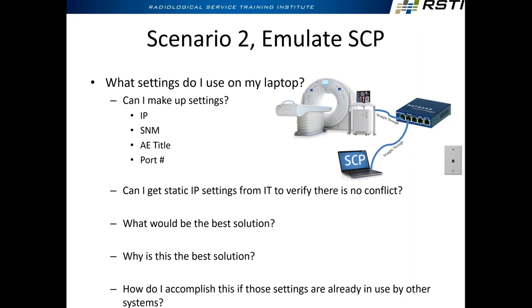Now, how do you send an image? Even if you don't know how to use the CT, you have the tech do it. Hey, send an image to PACS for me. So they're going to PACS, but in reality, it's going to go to your laptop. So you must have a switch to do this, or a crossover cable, or a smart NIC, which will do auto crossover for you.